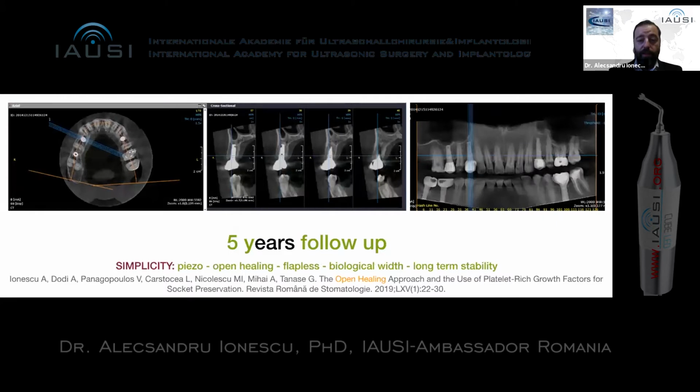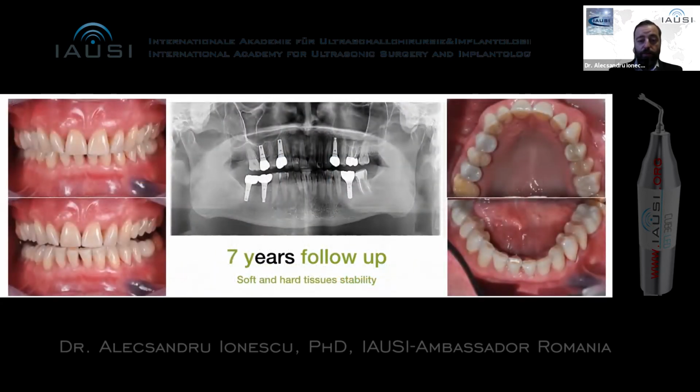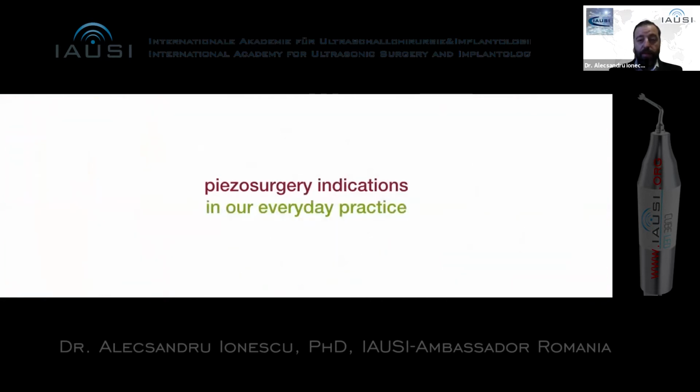And the CBCT scan after 5 years as we proceed with our simplicity concept. So piezo for extraction, open healing in terms of socket preservation, flapless approach for implant insertion, biological concept of prosthetics, and a long-term stability. And again, 2 more years later, 7 years follow-up, you can see it's also a very good stability on the X-ray and the clinical aspect.